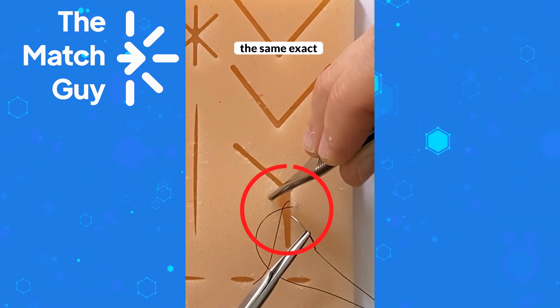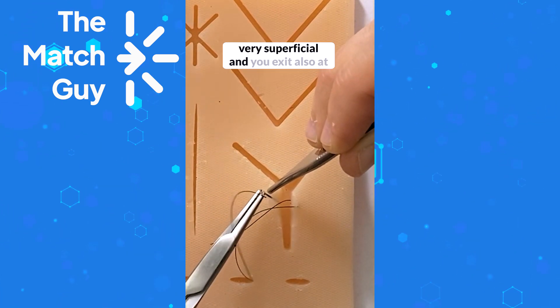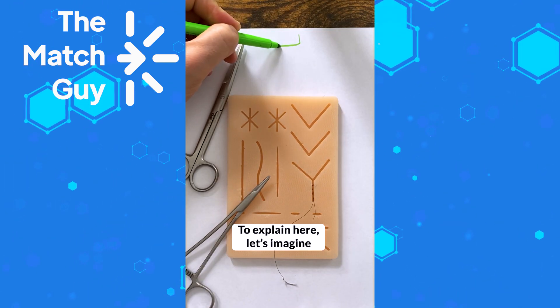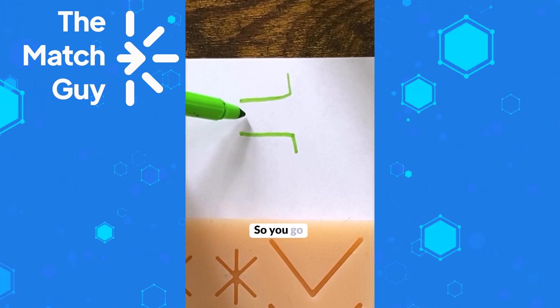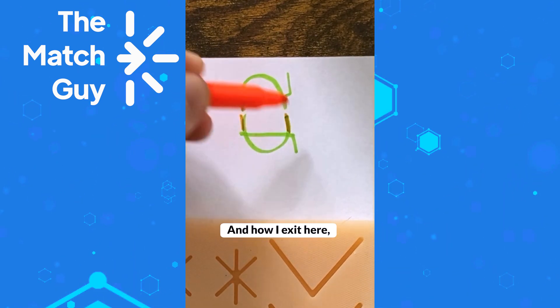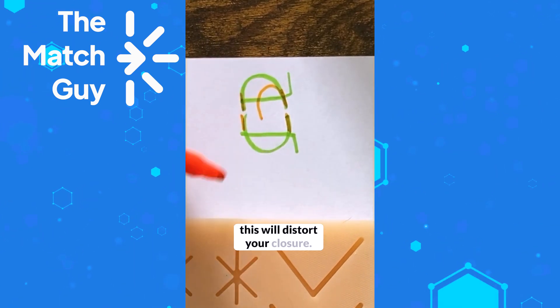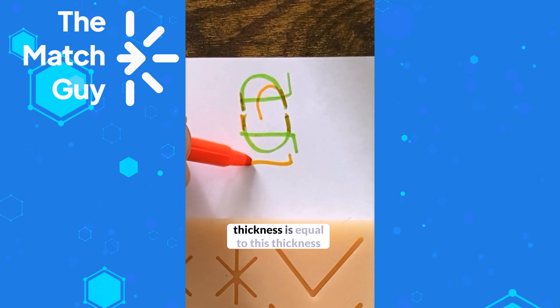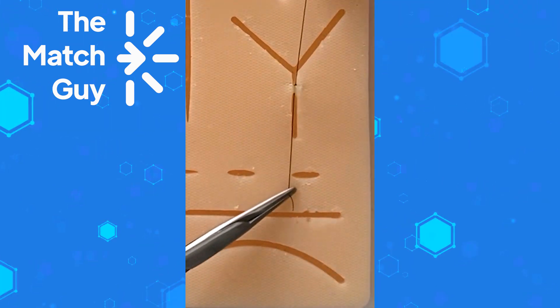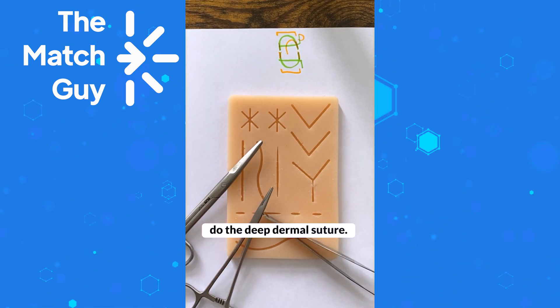Now we're going to go superficial to deep. Make sure you take the same exact thickness that you took on the other side. So if you came very superficial, you need to start very superficial, and you exit at the same thickness that you entered. The edges should match: you go deep to superficial, then superficial to deep, and how you exit here should be at the same level you enter there. If the thickness is unequal, this will distort your closure. Make sure you don't go through the skin. Now tie the suture and cut it very close to the knot. That's how you do the deep dermal suture.